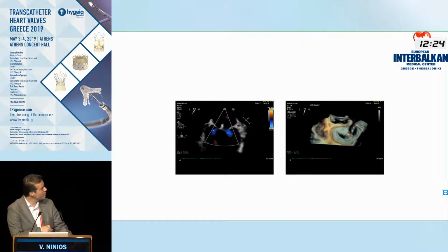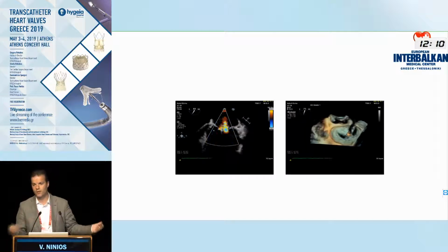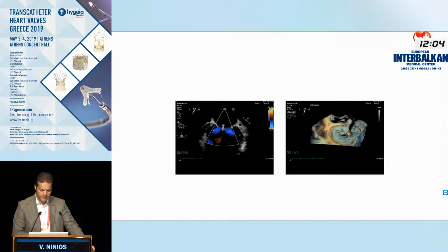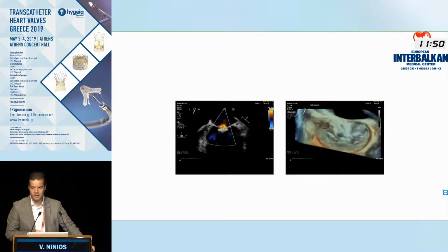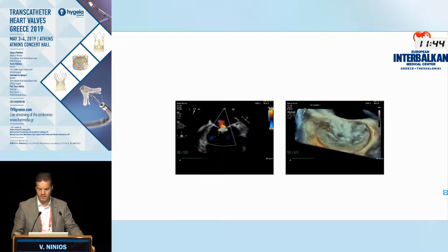This clip is put medially on this jet, and we can see that it's already reducing the width of the jet. So the medial part of the jet is becoming narrow, almost gone, and there is a significant lateral part. Now this is possibly a 2+ MR. Maybe some would argue it's a 3+ MR, but clearly we would not accept this as a final result. So here is a second clip, which is put just lateral to the first one and clearly reducing the lateral part of the jet. And now we can see two clips, body clips, parallel to each other, creating this three-dimensional image. So I think nobody would argue that this is a situation that two clips are necessary.